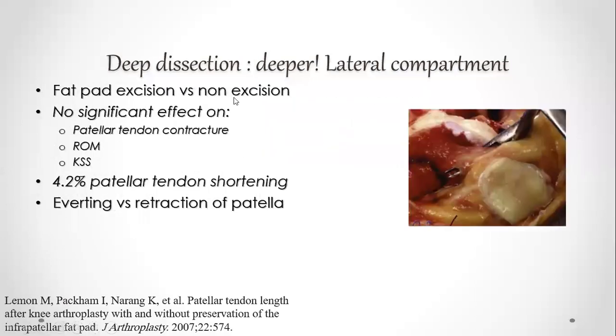Here you can see in the lateral compartment the fat pad excision versus non-excising. When you flex the knee and the patella is very difficult to retract, you have to evert it. So in extension of the knee, you can do elevation of the patella and go for the fat pad, whether it is excised or not, I will talk about later.